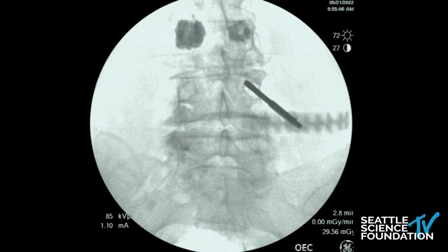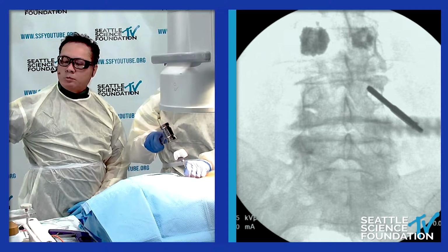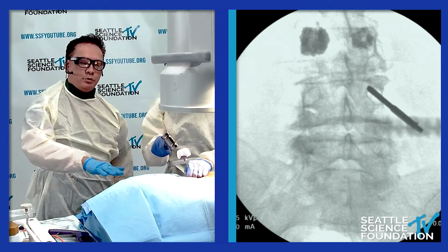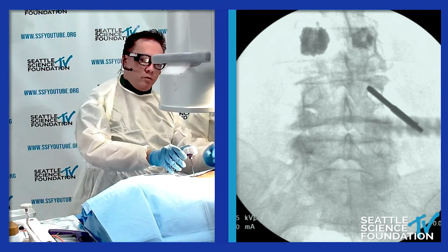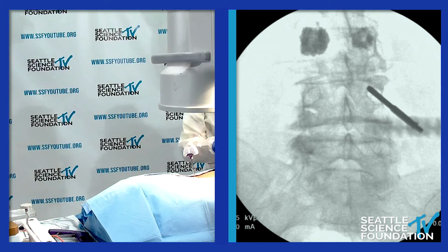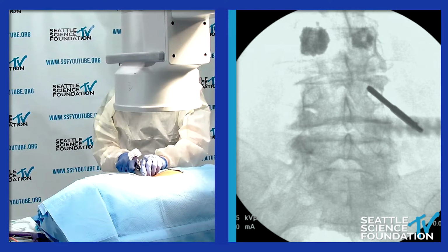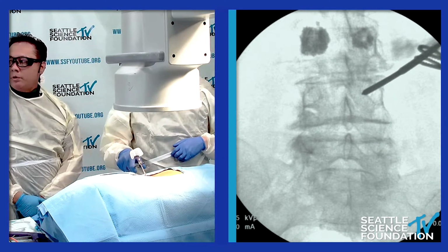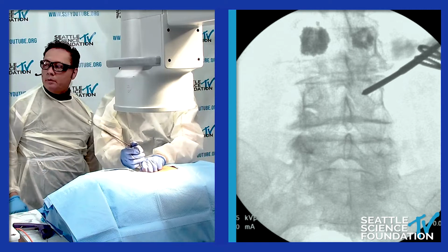So our typical approach, especially in the AP view, because we're trying to access the actual area in particular, is that we're going to go from the more 2 o'clock position and point towards the opposite vertebral corner. And so we're going to start more at the 2 o'clock area of the pedicle and access it that way in this type of approach.